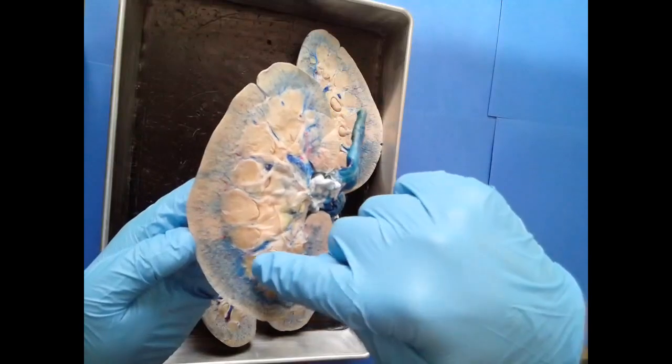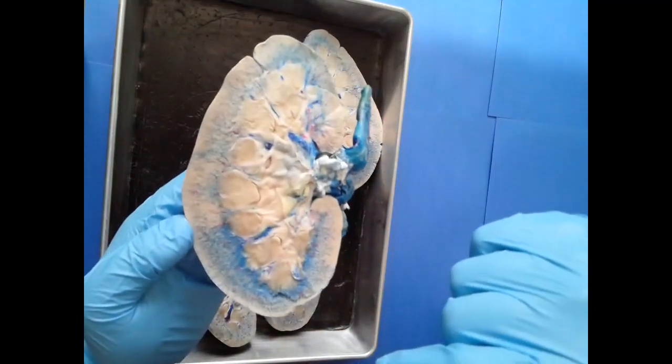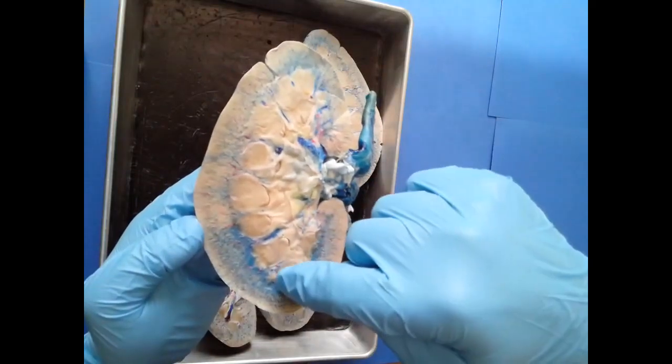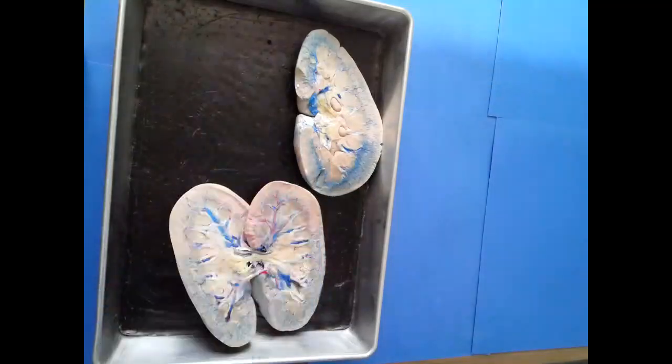Then you see these darker colored areas that have a very triangular, almost pyramidal shape. Those are called renal pyramids, which are also within the renal medulla, the middle parts of the kidney. All right, and then, oops, my probe.